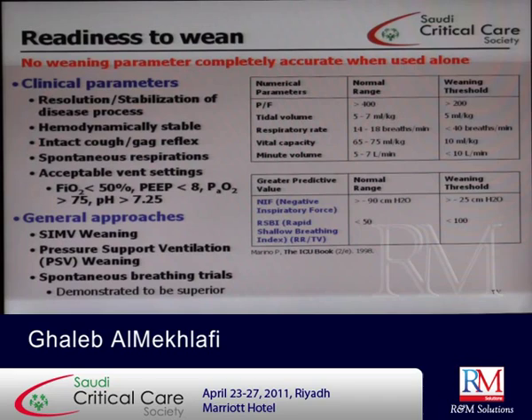And also we have numerical parameters. This is the P/F ratio, which is the PaO2 divided by FiO2. It should be more than 200. Tidal volume more than 5 ml per kg, respiratory rate less than 40, vital capacity more than 10 ml per kg, and minute volume less than 10.